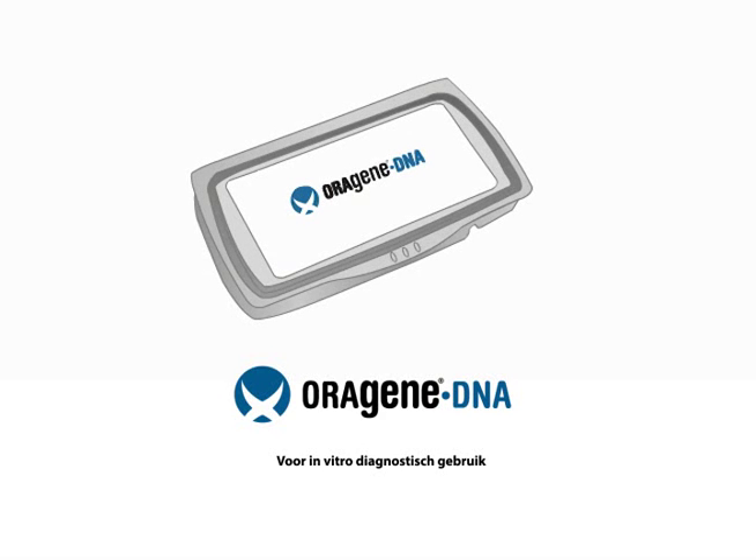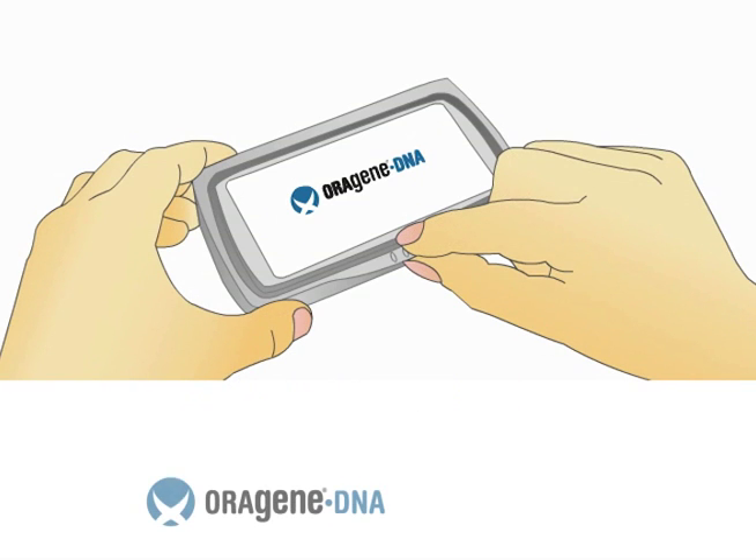The Oragene DNA Self-Collection Kit is proven for the collection, stabilization, and transportation of DNA samples from saliva.